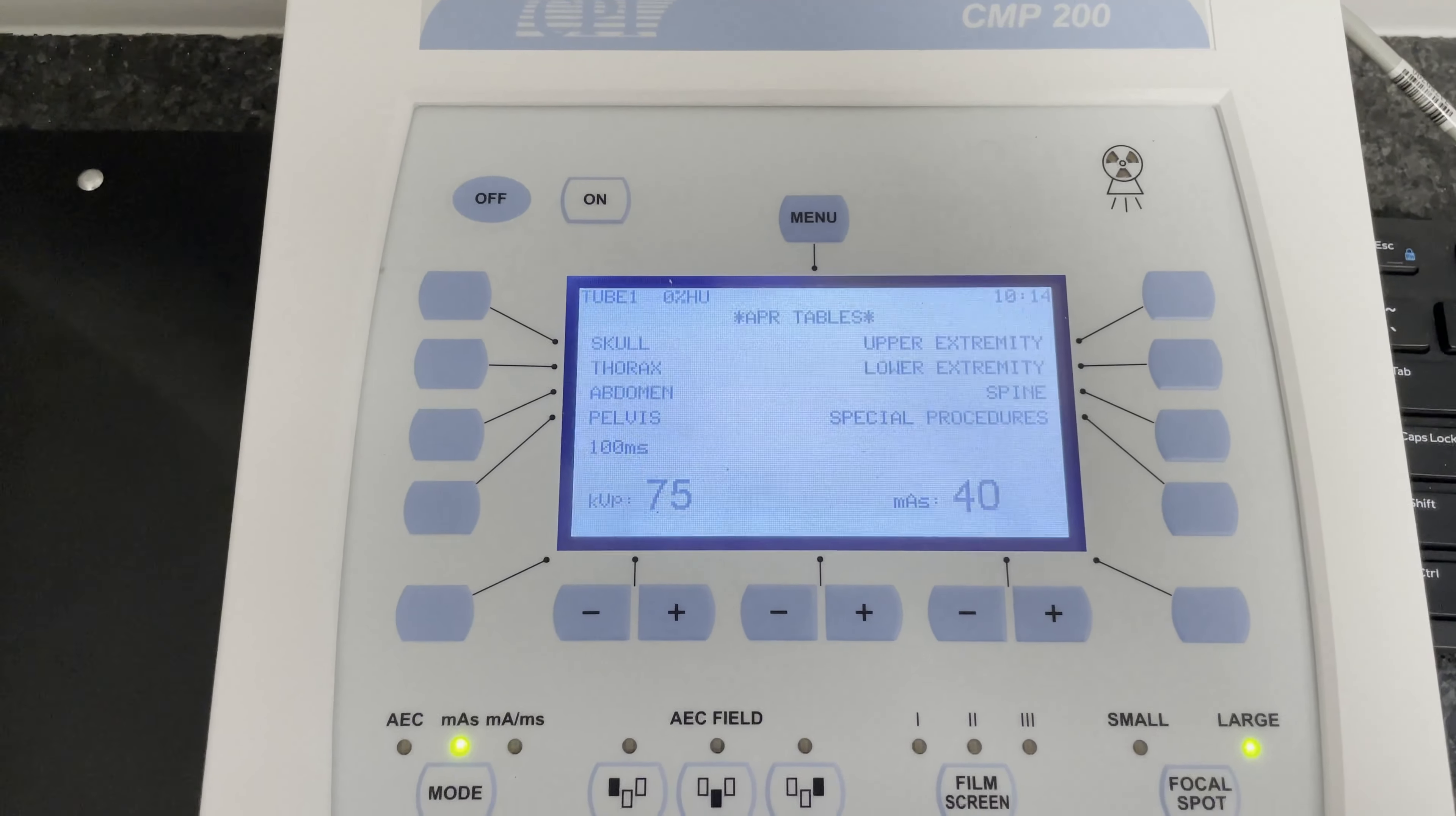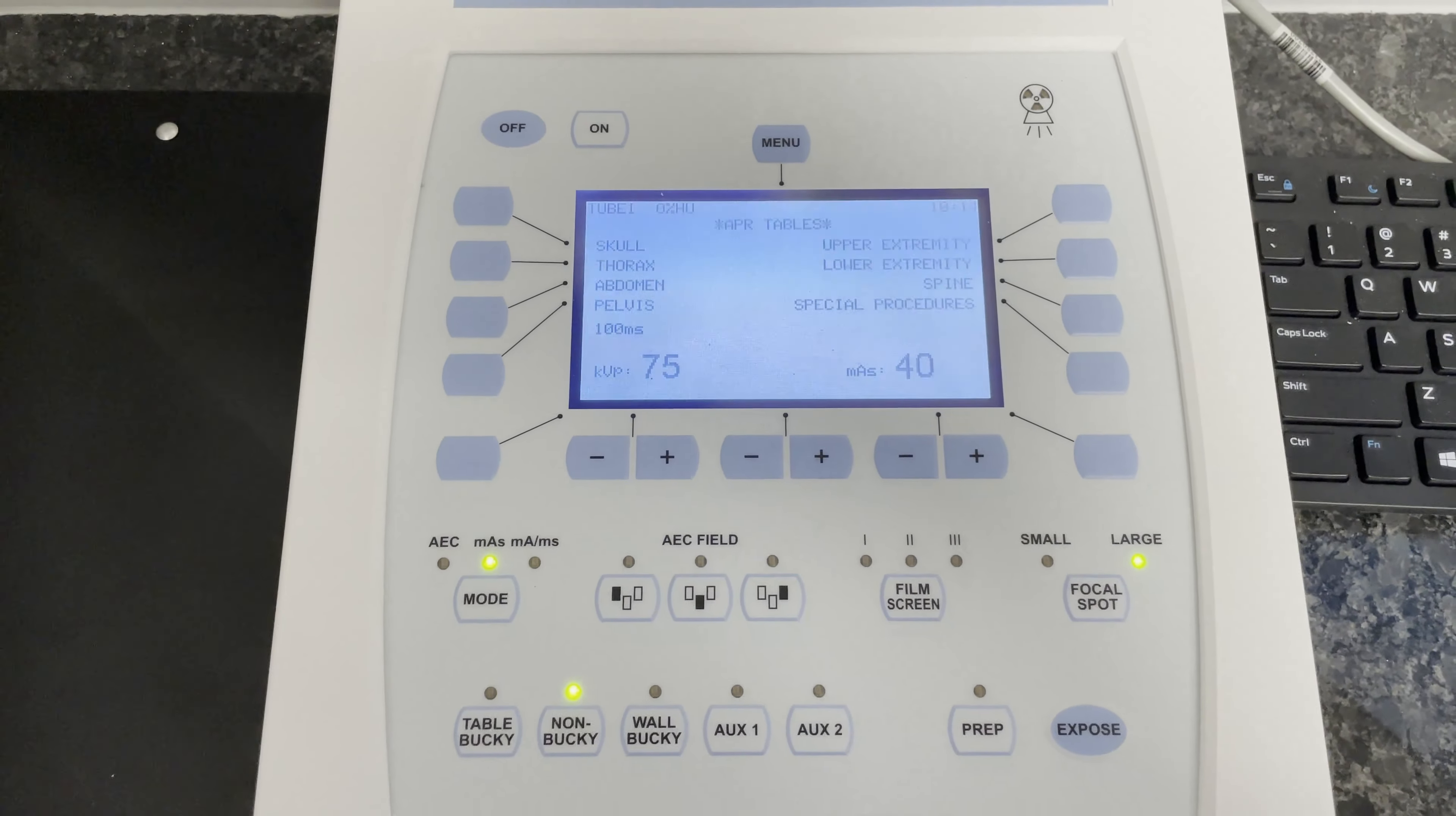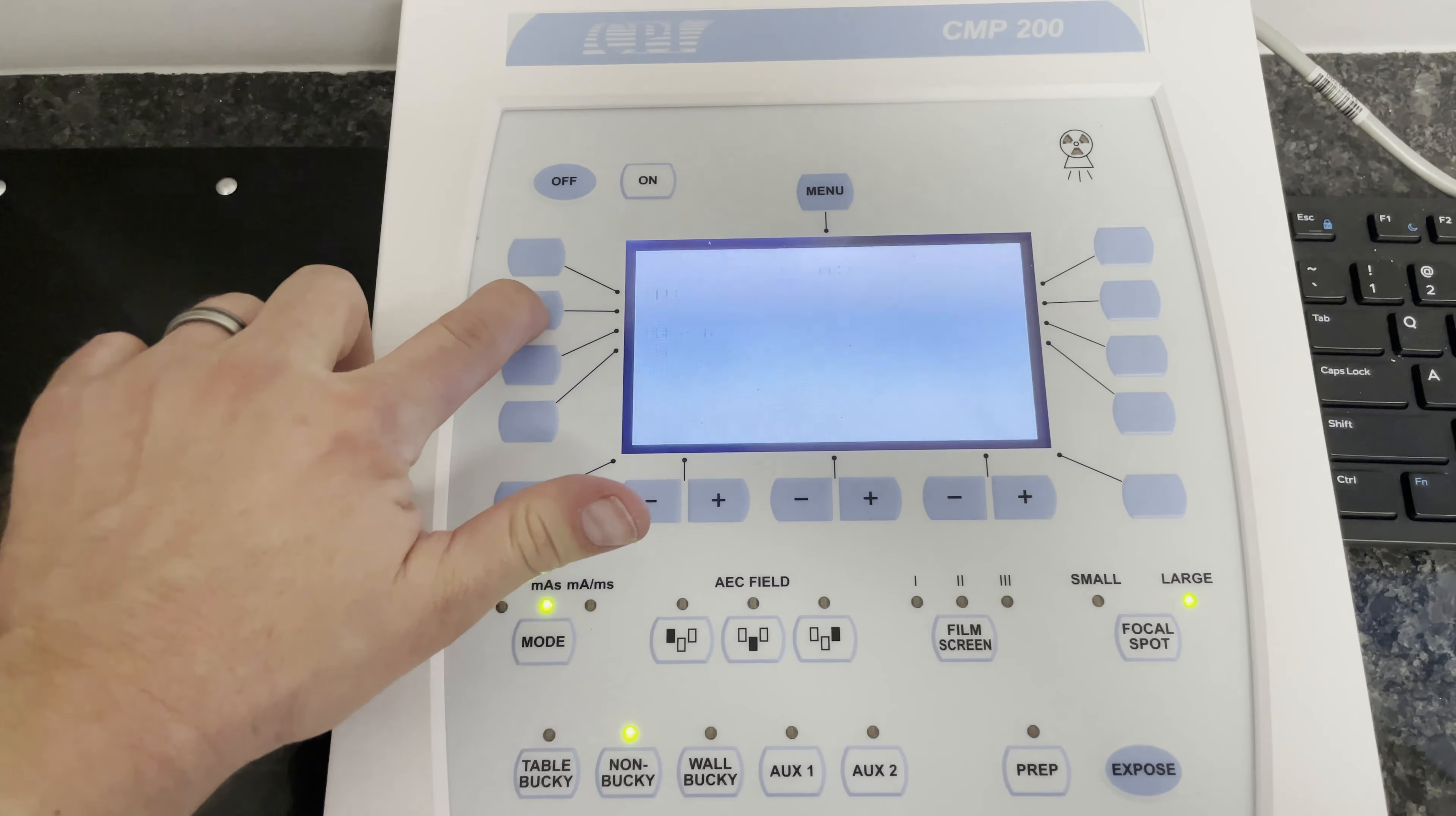When you see this screen, you can now choose the anatomical region that you would like to take an x-ray on. So for an example, if you want to do a thorax, click thorax.